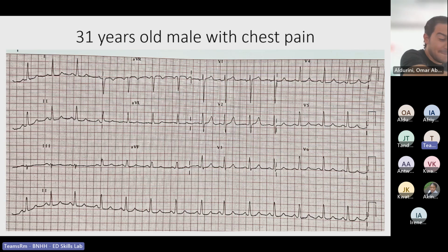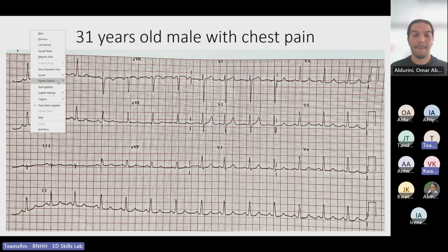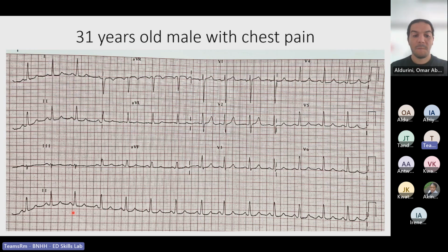It is, but it looks a bit faint, I think. Let's have a look at the P, QRS, and then the T wave. P, QRS, T, P, QRS, T, and they are all present and persistent and consistent. There's nothing missing in between. Okay, this is a complete ECG.